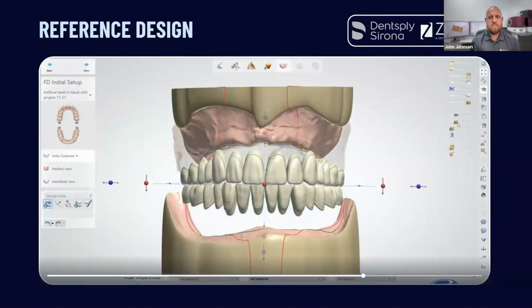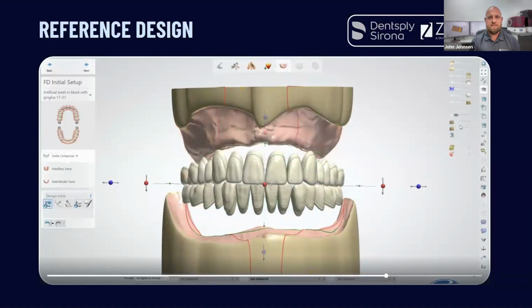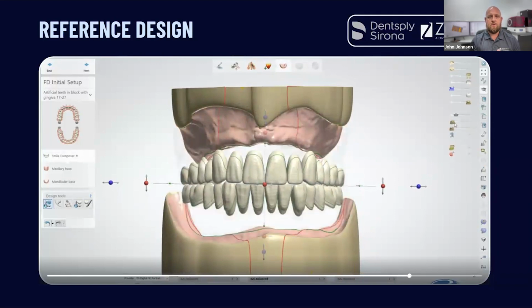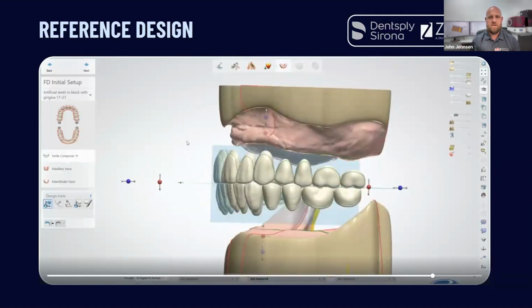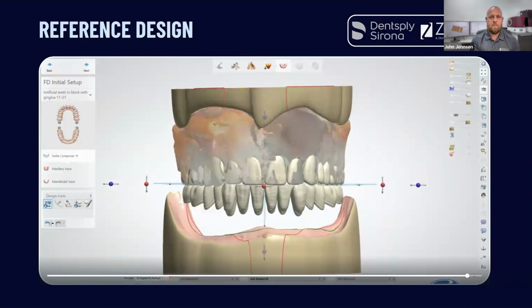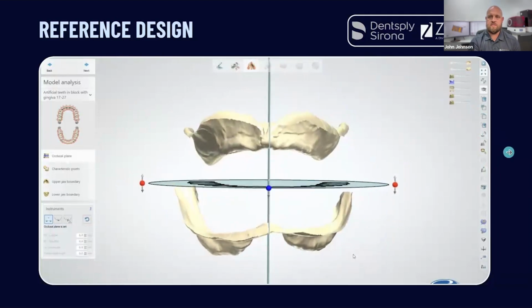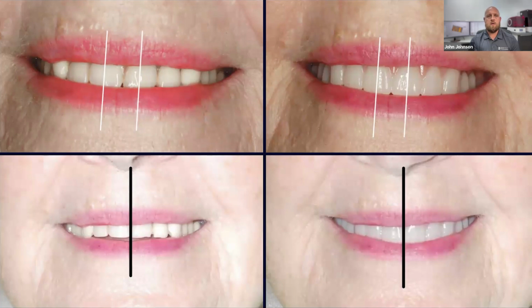I'll show you. This is the arrangement, and then that's her existing denture. So you can see just kind of like that immediate denture arrangement that we did. I'm able to get that arch width where I want it. I'm able to make all the teeth the same shape, mold, form that she's accustomed to. And I'm even able to see that I've corrected that reverse smile by bringing that incisal edge down just slightly. And then you would go through with the rest of your design the same way you would with creating any other denture. This was our outcome.